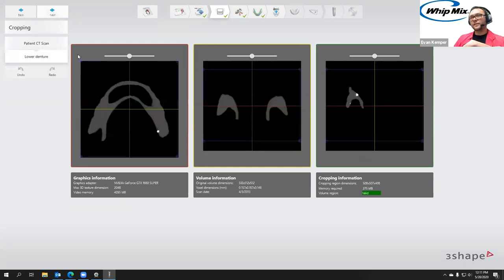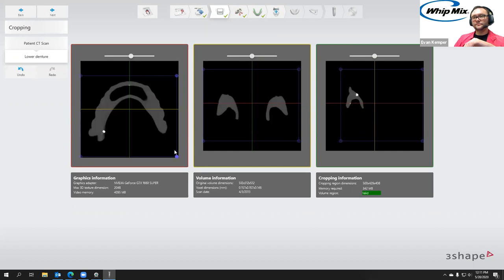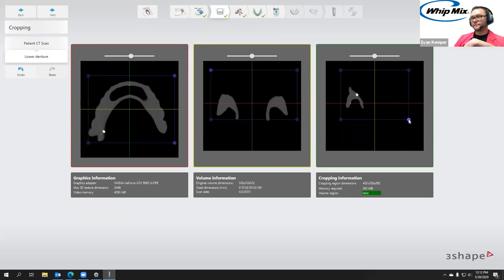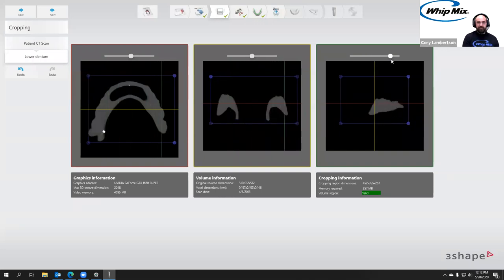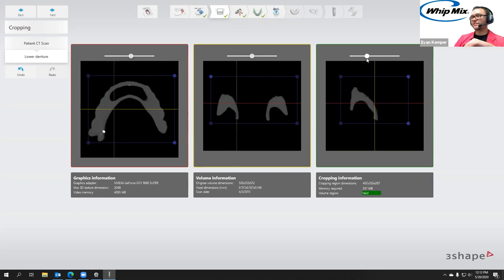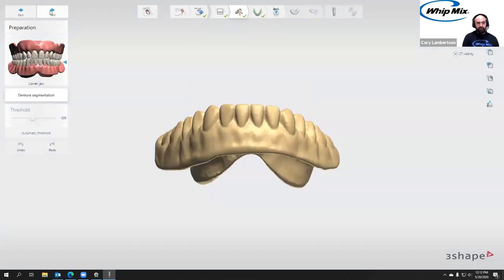We'll go next. Same thing here — crop the lower denture, make sure we don't trim too much. Remember, this will also end up being the surgical guide. If you were to trim too much, the software gives no warning because it assumes you know your anatomy and what you need. So if you trim too much, make sure you go back and fix it before proceeding. You can always hit back and change the cropping region.